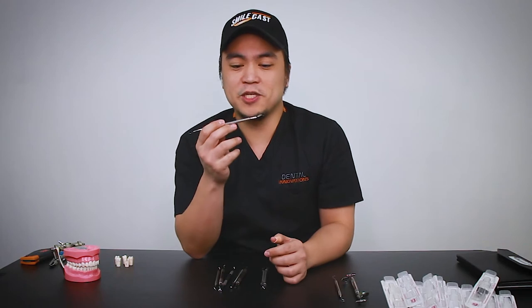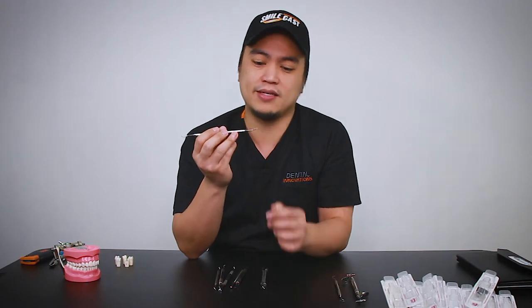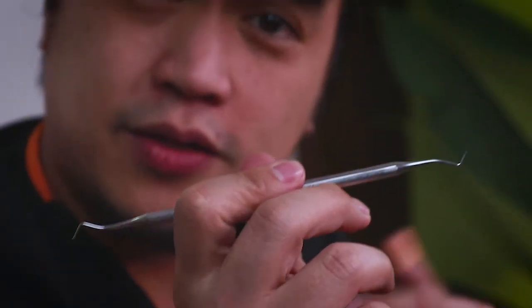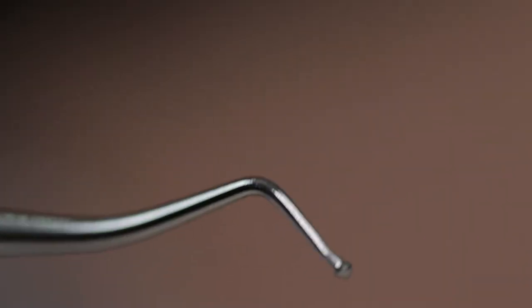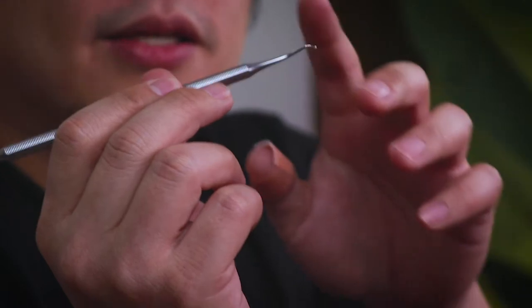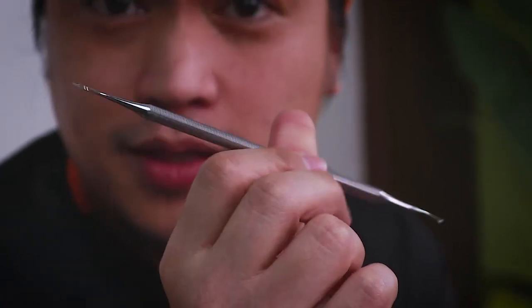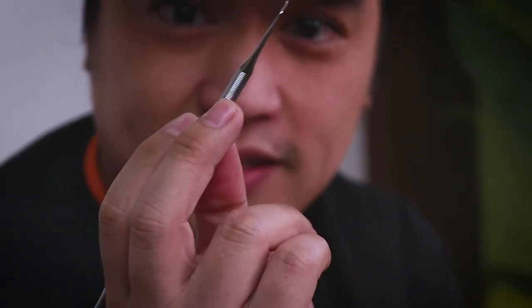Next up, we have the spoon excavator — another basic instrument you're gonna use in dental school and in everyday practice. The spoon excavator is used for removing soft dentine without a bur, so basically just using hand movements. If I take a look really close here, you can see that it's quite sharp on both ends, which means minimal effort when I'm doing manual debridement of cavities.